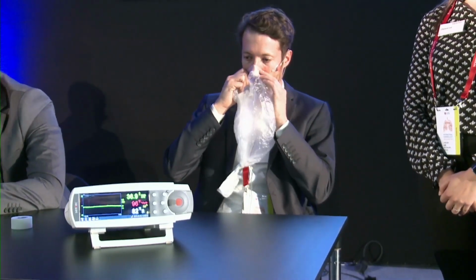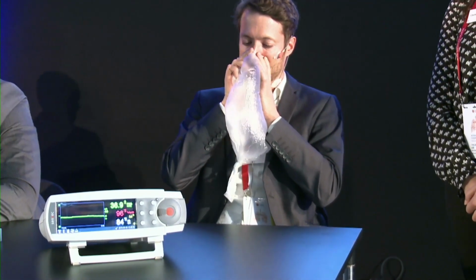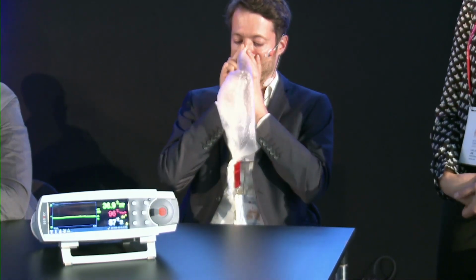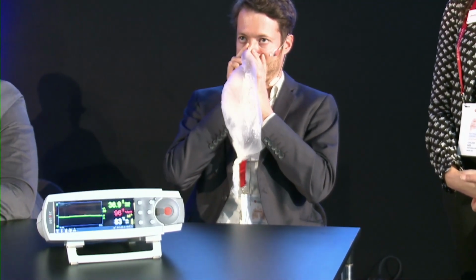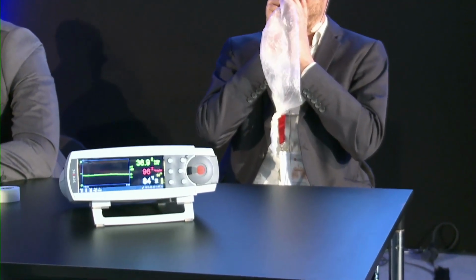For sure, there is a physiological delay once the hyperventilation or the hypoventilation occurs in the lung, until we can measure that in the area where you have positioned the sensor. So the change should occur within 30 to 60 seconds. So let's see on the monitor. It still takes some time, but hopefully it will increase soon.